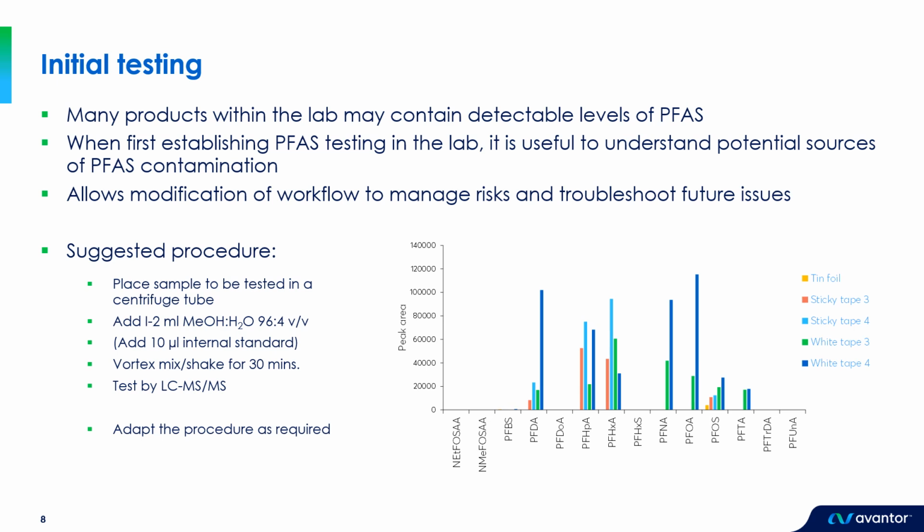On the chart to the right, you can see examples of materials we tested. So sticky tape and white tape, which we use typically extensively for labeling samples, were not surprisingly found to contain detectable levels of several PFAS. Things like sticky notes also gave a positive hit, suggesting that avoiding any sort of sticky substances might be a general good rule of thumb.